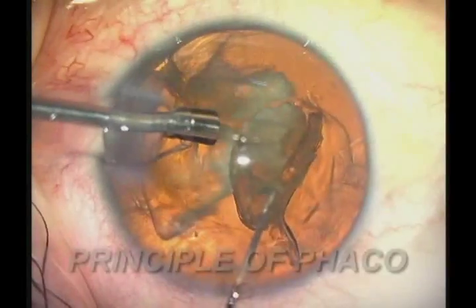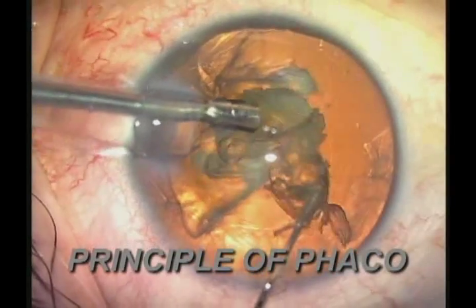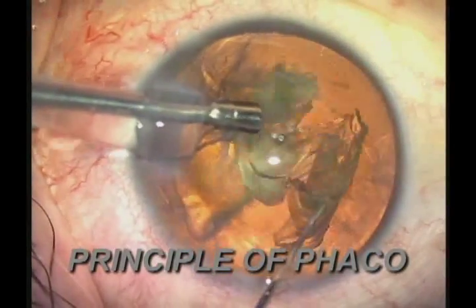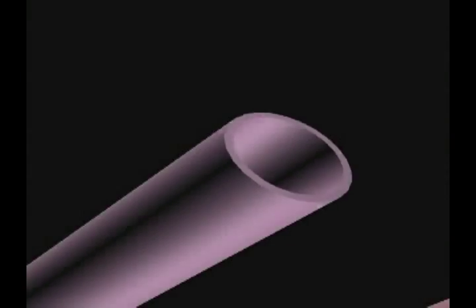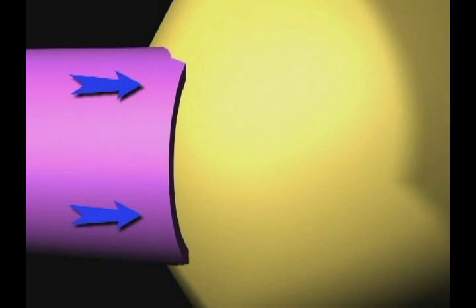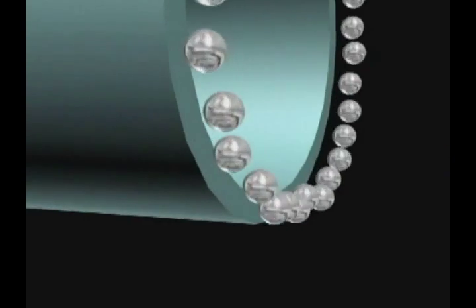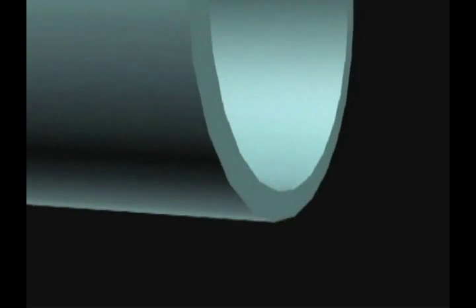There has been active debate over the fundamental physics involved in phaco emulsification. Many believe that the forward displacement of the phaco tip directly disrupts the lens in an action known as the jackhammer effect. Others propose that the lens-disrupting power of phaco lies in energy released by collapsing bubbles created by acoustic cavitation.